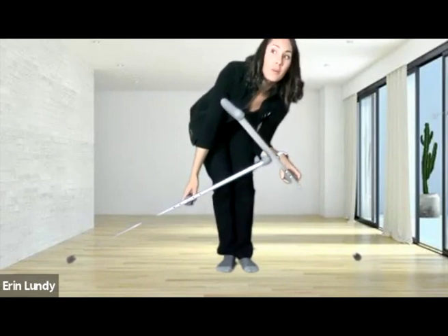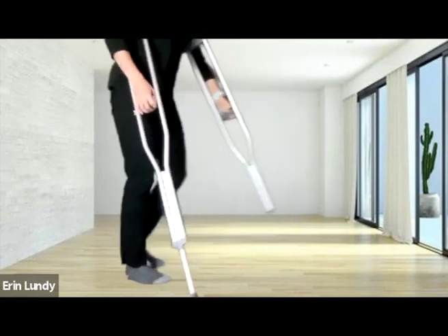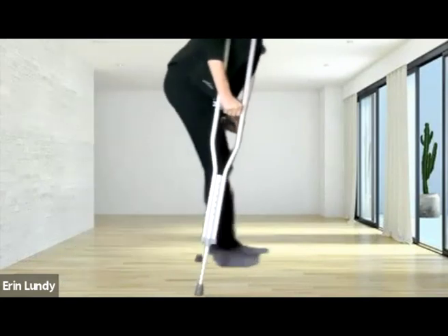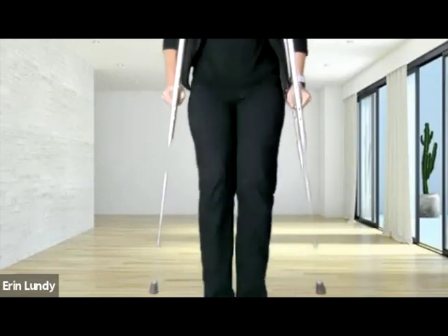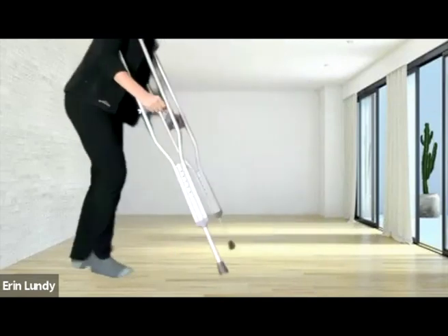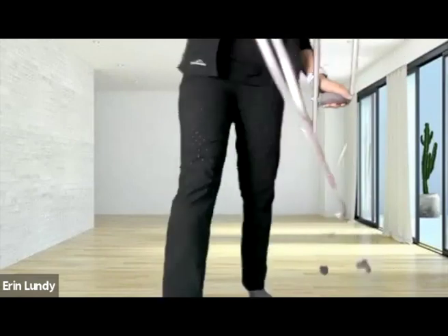Now, next level up, and again, this is all your therapist's judgment, is swing through gait. This one is, again, a little bit more advanced for those kids that are a little bit more coordinated and active. So it's exactly what it sounds like. Put your crutches forward, and you're going to swing through all the way to the other side. Crutches forward, swing through to the other side. This one can get a little dangerous if they overswing and they jump and go forward. So they might crash. So again, this is up to your therapist's discretion if they think that your kid is ready for this. They have a lot of fun with it because, again, they're kids.